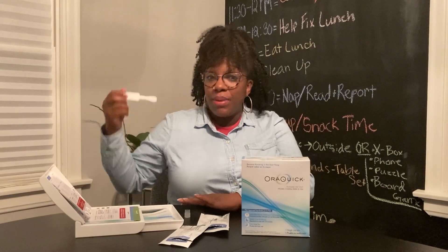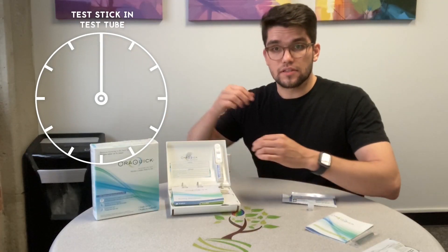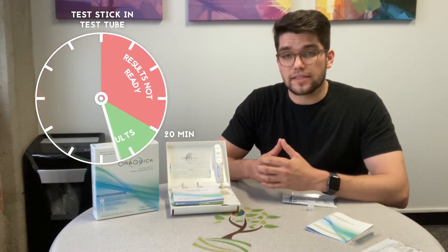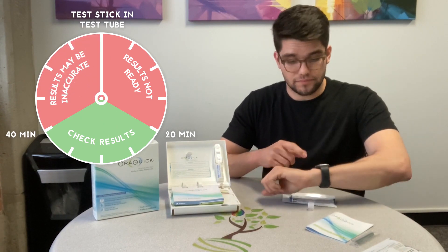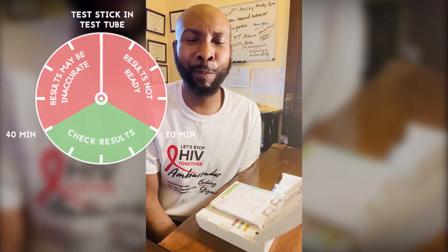Step four is placing the test stick in the tube, head down first. You're gonna want to check your results between 20 and 40 minutes after you put the stick in the test tube. I'm gonna hang out here, turn on some music, and wait on my test to see what my result is.